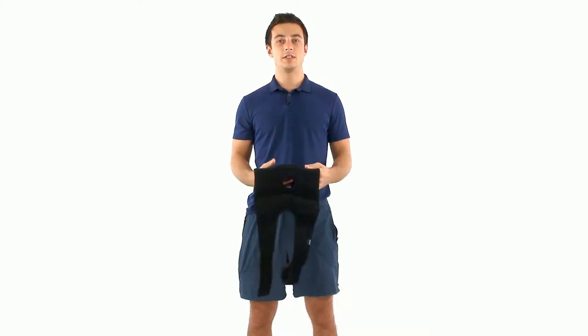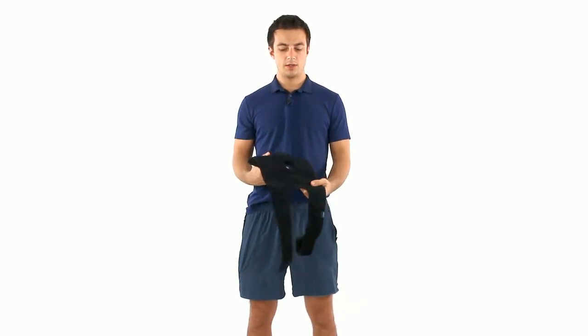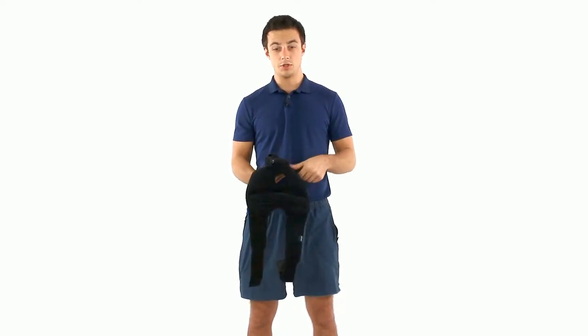Hey, it's Joe with Vive Health. Today we're going to talk about removing the stays from the hinged knee brace. I have one here. It's gonna have two aluminum stays, and you're gonna want to remove these if you're gonna wash the brace, which I hope you do.